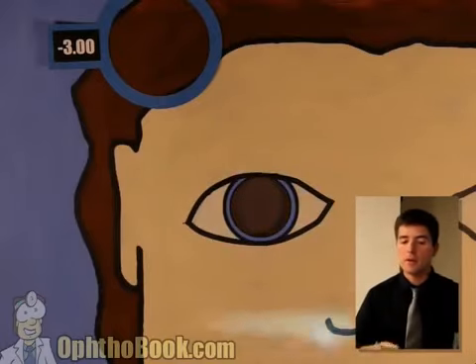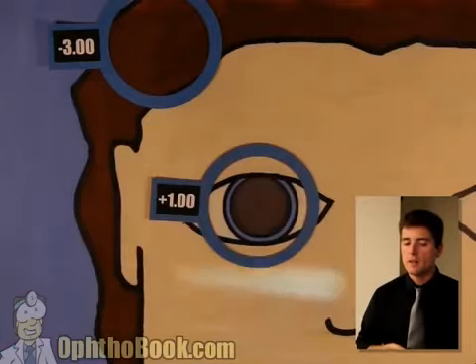Plano. That's a diopter stronger than -1. No, not quite there yet. +1. I think we're getting closer.